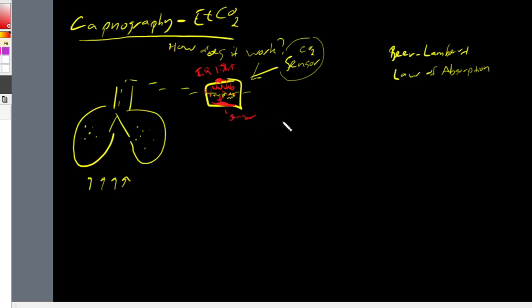This sensor signal is going to be analyzed using a graph, and that is going to reflect how our carbon dioxide concentration changes throughout the respiratory cycle. We'll get into this part in another video.